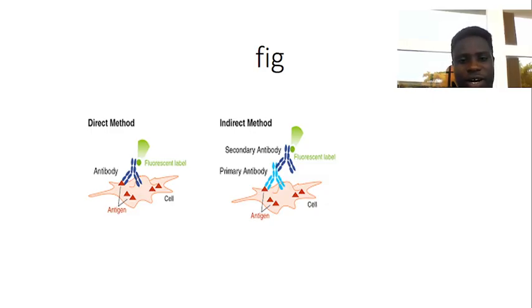The secondary antibodies increase the signal and the specificity of the antigen-antibody reaction that can be detected with the dyes, making it easy to detect under the right microscope.